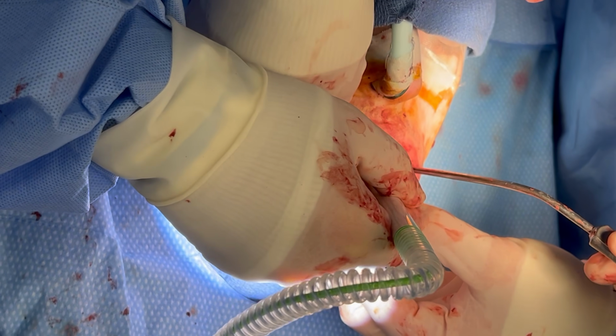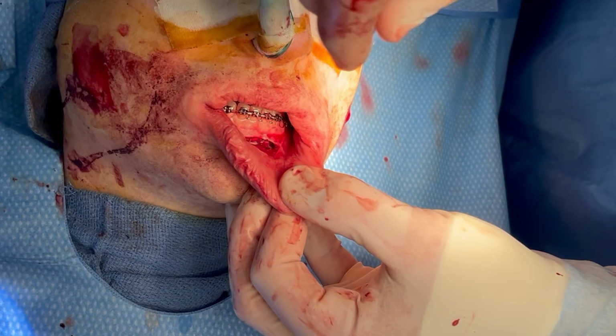Next, we perform a genioplasty to correct the chin deviation. I first make a vestibular incision and expose the symphysis.